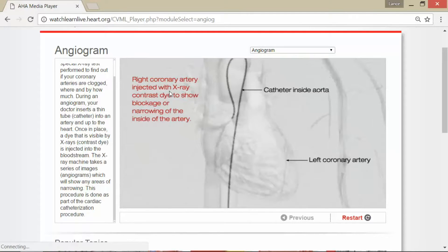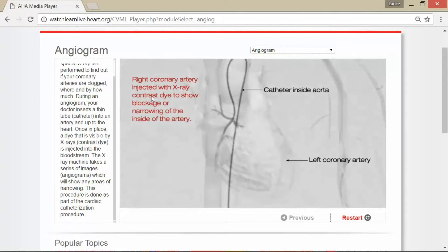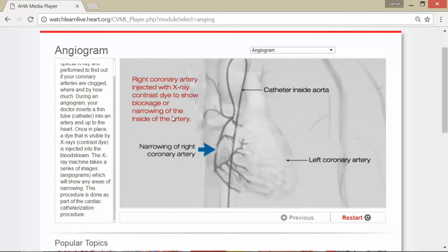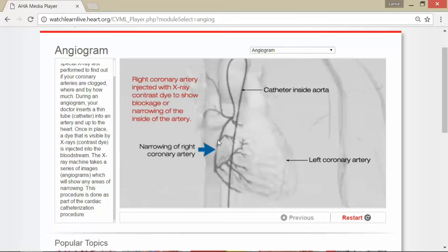The right coronary artery is then injected with the x-ray contrast dye to show any blockage or narrowing of the inside of the artery. This has revealed a narrowing of the right coronary artery, indicating plaque buildup — this is one way you can tell what's going on in the heart and if there are any blockages.